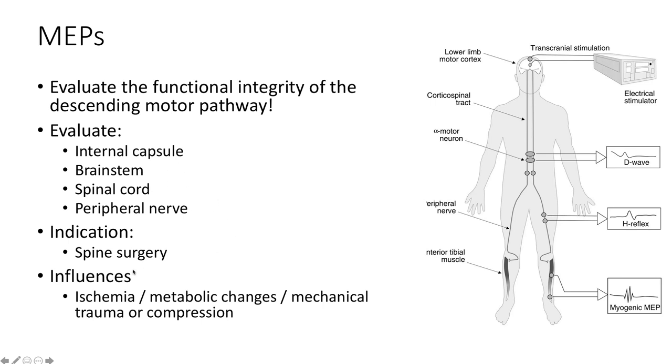peripheral nerve. Also here, spine surgery, but it's a different area of your spine. As we know, we have the dorsal columns and we have the anterior, the more motor tracts. So there are two different areas I look at during spine surgeries with SEPs and MEPs combined. The response itself takes less than 10 seconds to obtain. Same threshold of pathological than we use for the SSEPs.